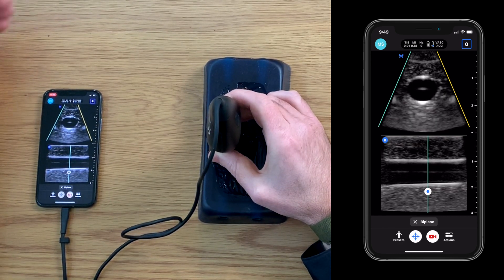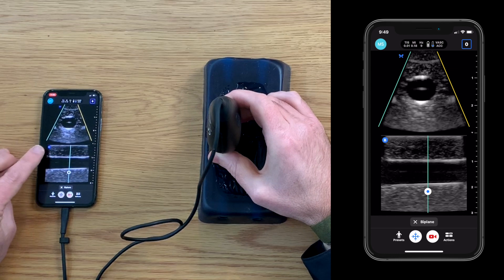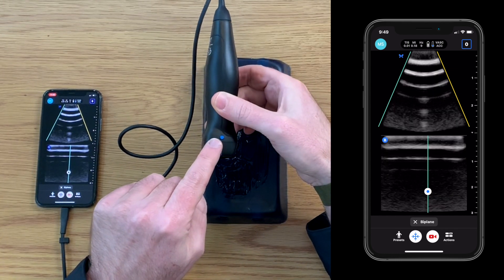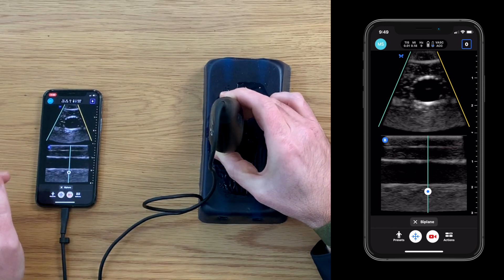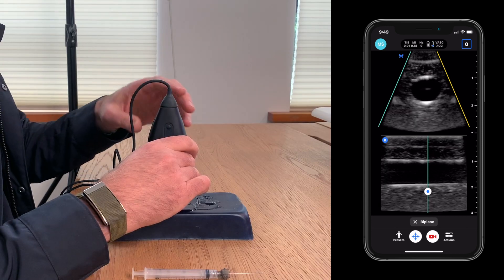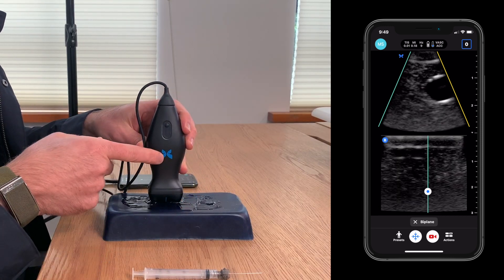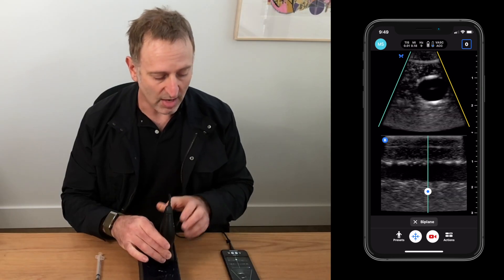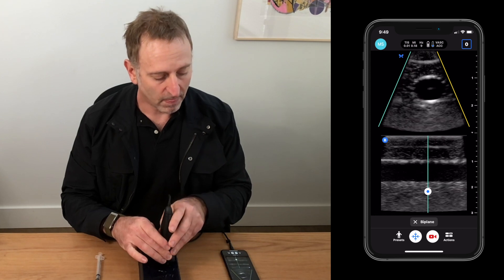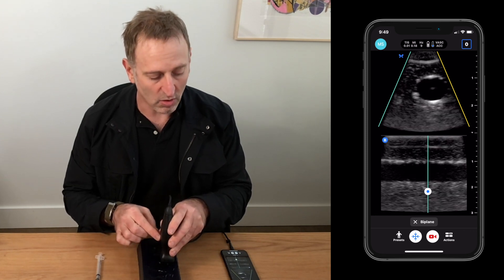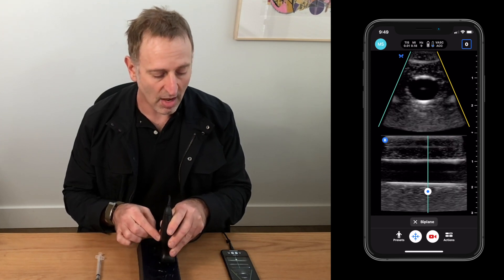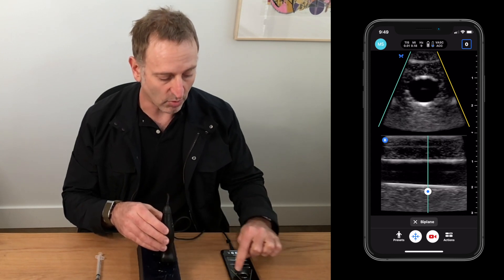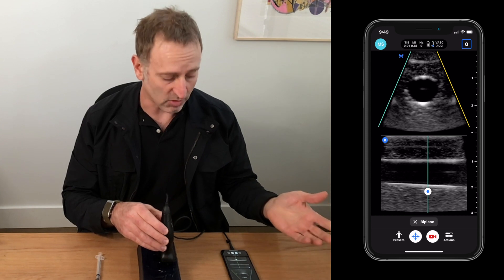On the bottom image, the B corresponds to the blue dot on the ultrasound probe on the IQ+. On the top image, the butterfly icon on the left corresponds to the butterfly icon on this side of the IQ+. So that tells me that on the top image, the butterfly icon corresponds to the left side of the screen, and the opposite side corresponds to the yellow indicator — this bright line on the other side of the screen.